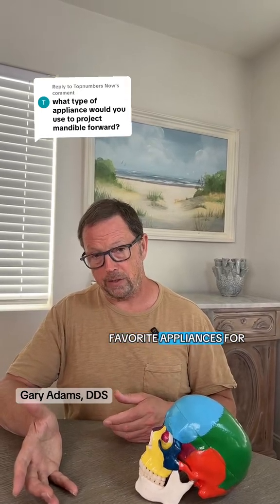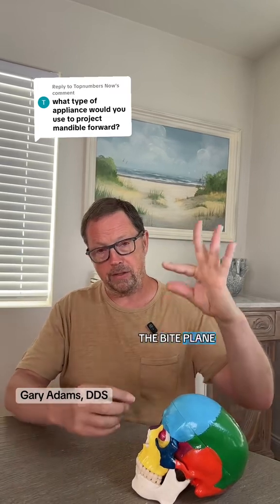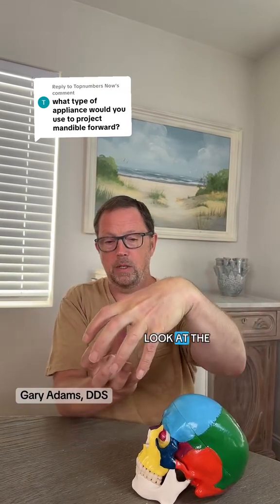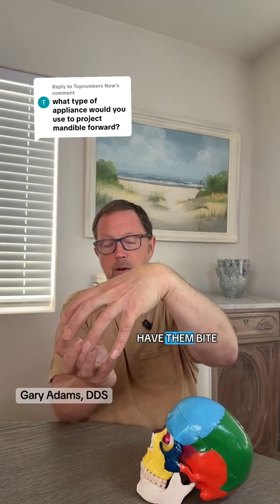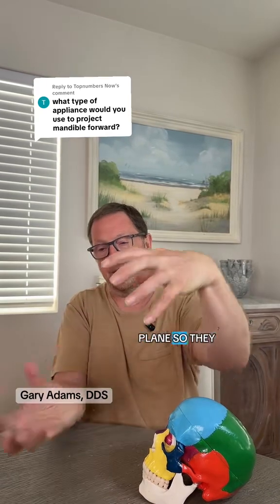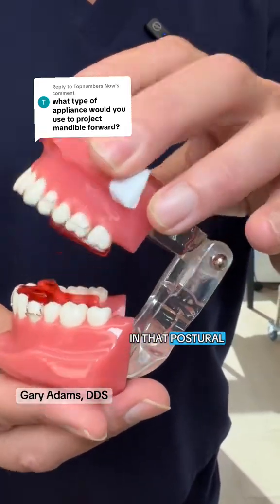One of my favorite appliances for kids is called a twin block appliance. It's an appliance where part of the bite plane is on the top and part is on the bottom. If you take a look at the lower jaw's neutral position — where the patient can remain in a neutral muscle position — have them bite a little more forward, and shape the upper and lower bite plane so they fit together like a puzzle. This really encourages that lower jaw staying forward in that postural position.